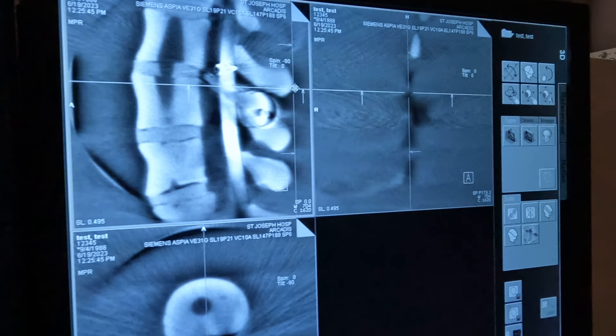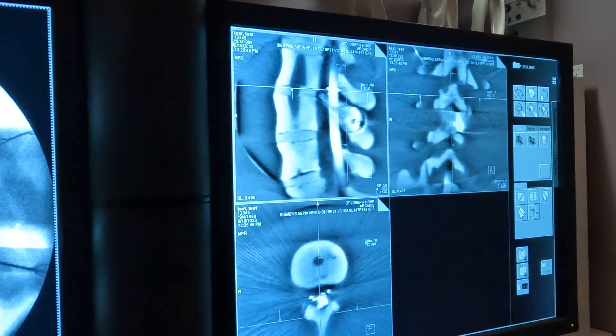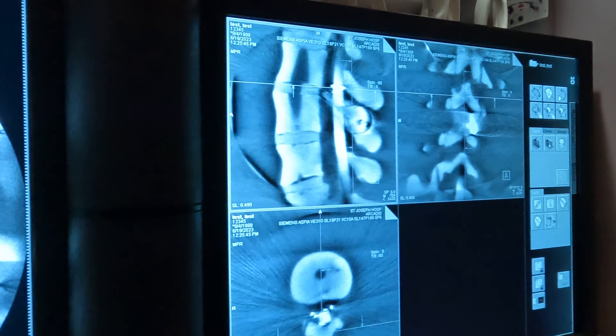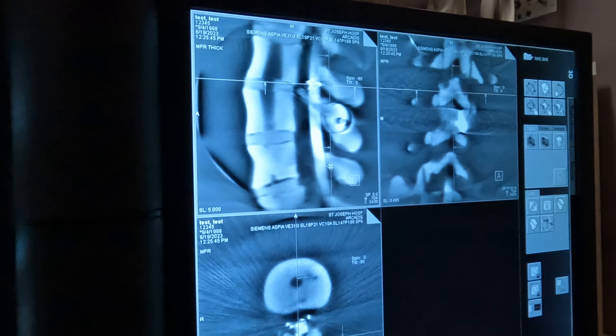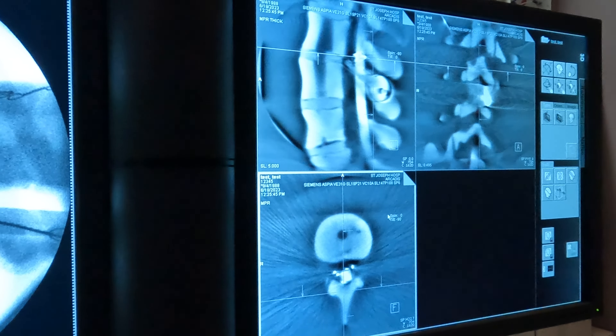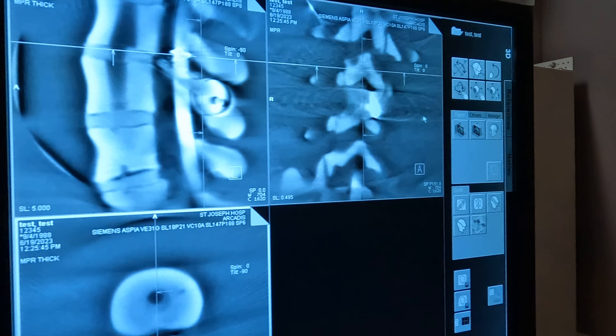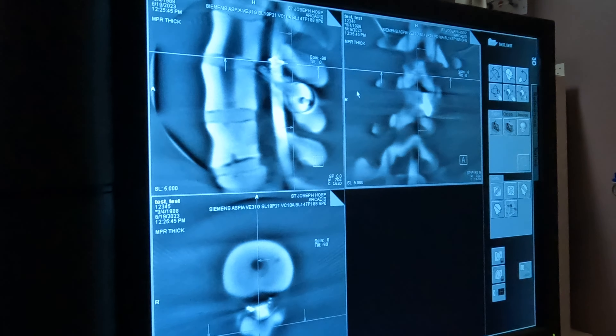Thick just means that you're clearing up your image quality a little bit. You'll click it here, you'll see that this box is highlighted, and you're going to make it thick. You'll notice that this one is much more clear. Click into another box, make it thick, click into this box, make it thick — they're all going to be thick.